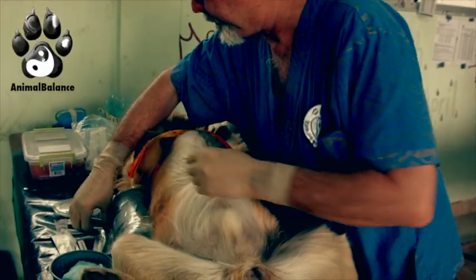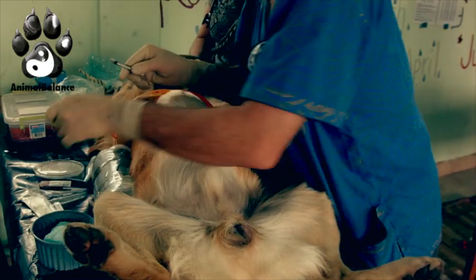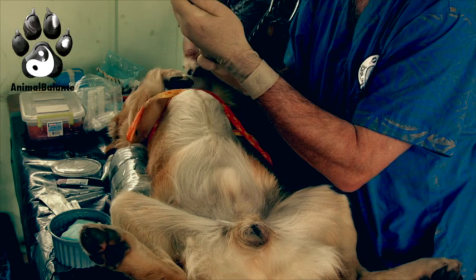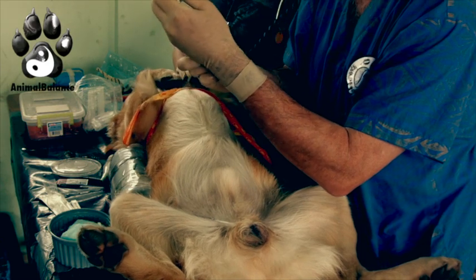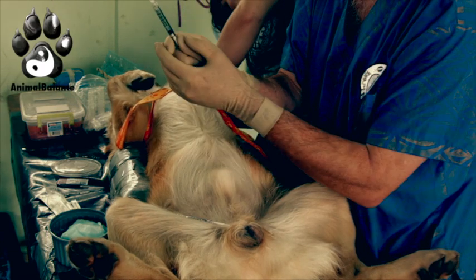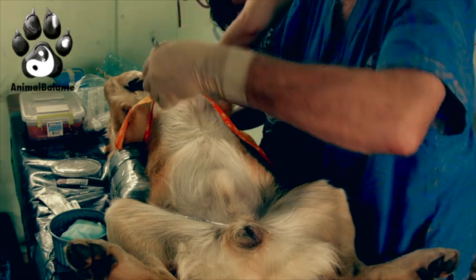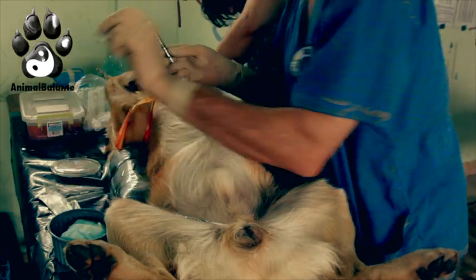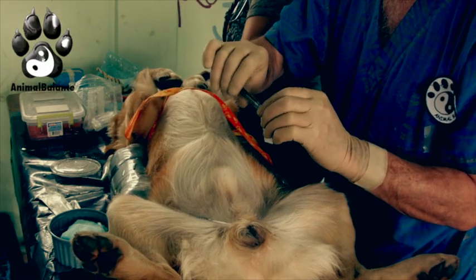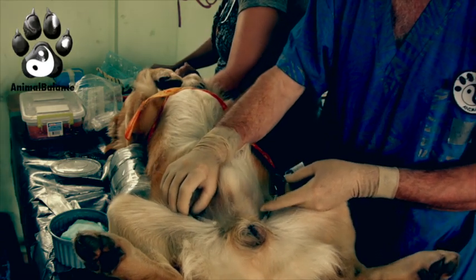I'm setting up the right side first since I measured that one first, then doing the same for the left. In this particular case the dog measured out equally, so each side is the same dose. We do want to pay attention to dose based on testicle size. Again, 0.8cc for each side. I switch out to a brand new needle and I'm ready to go — right testicle dose and left testicle dose both prepared.